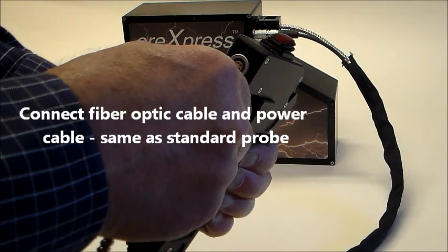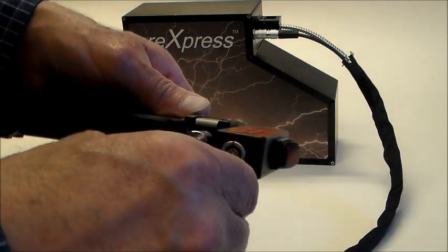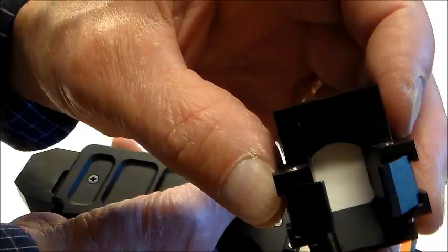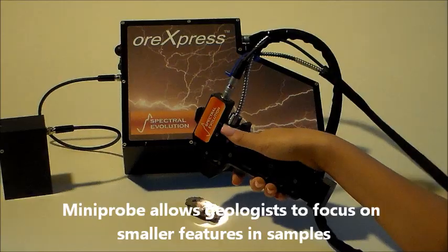The fiber and power cables connect the same way as the standard contact probe. On the bottom of the mini probe handle is a built-in white reference standard. Unclip it from the probe, clip it over the probe window, and take your reference scan using the Darwin software.